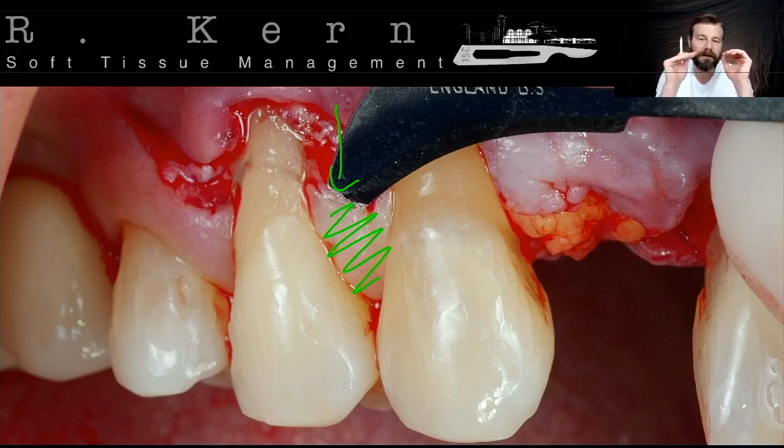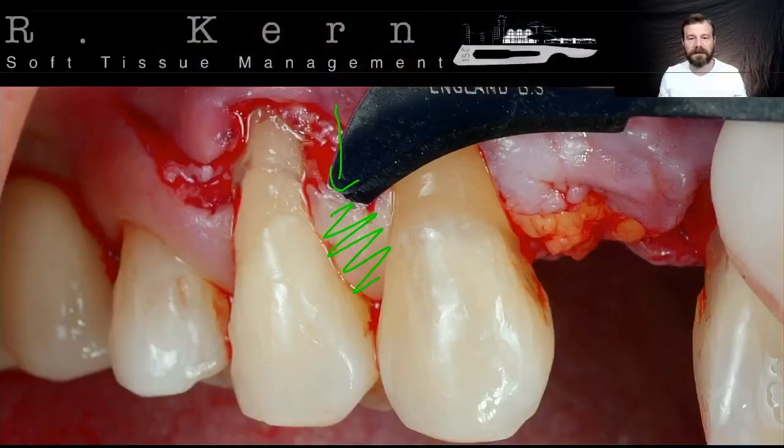If you try to preserve something here, you will probably leave some epithelium still there, maybe some keratinization, and with epithelium, when you bring the flap over, the nourishment is not good, and on the post-op for your patient, you're going to see on the healing a small papilla being loose, not fitting in place, not integrated in place, okay?